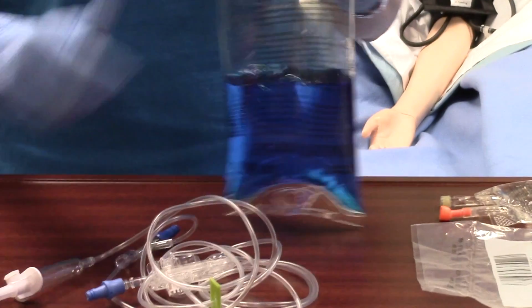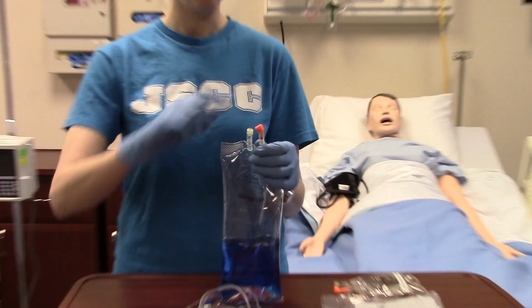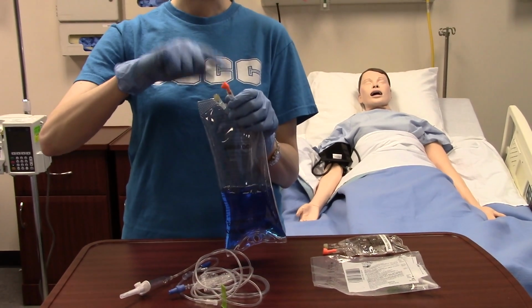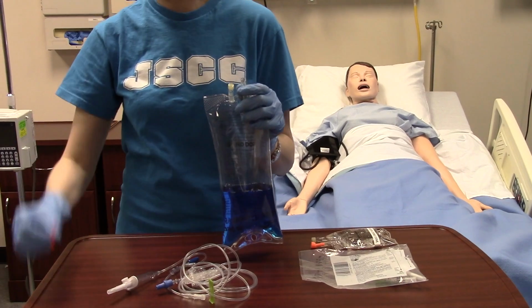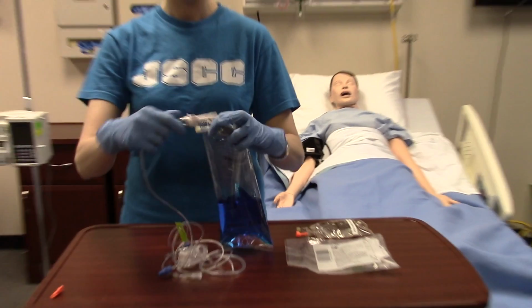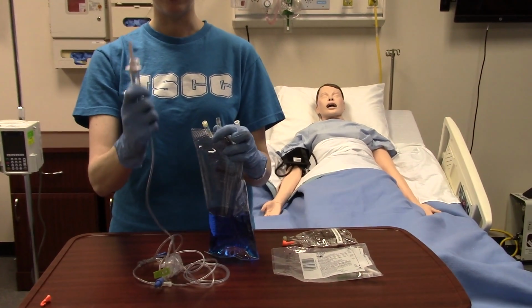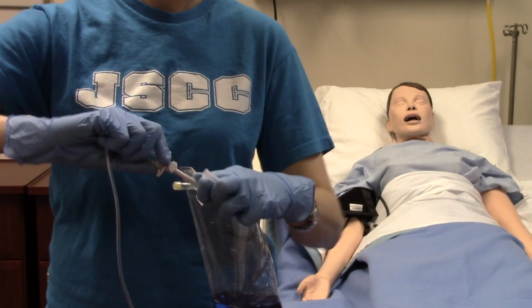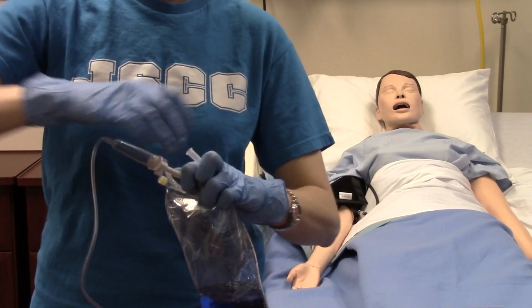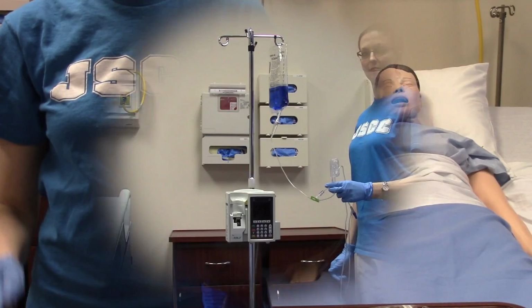So now we're going to spike our bag of fluid. For today, this bag has already been used, which is why it has the little ear plug in it, but that's how you know we reuse bags around here. Make sure not to touch the spike. This is sterile. And now we're ready to go hang our bag of fluid.